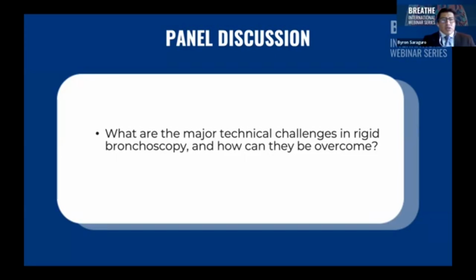To finish, it's important to mention that the technique of dilating stenosis does not involve excessive force, to avoid injury of the normal surrounding trachea. It's very important. We must avoid excessive force when manipulating the rigid instruments.